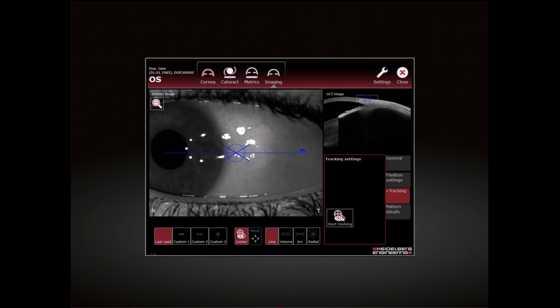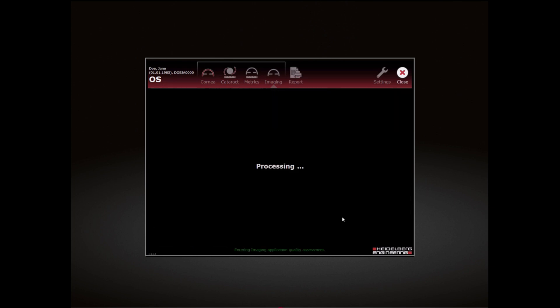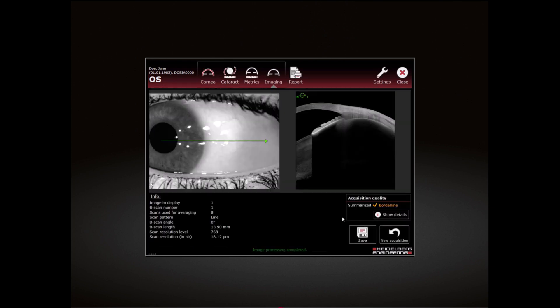Press the joystick button to start the acquisition. The examination stops automatically.